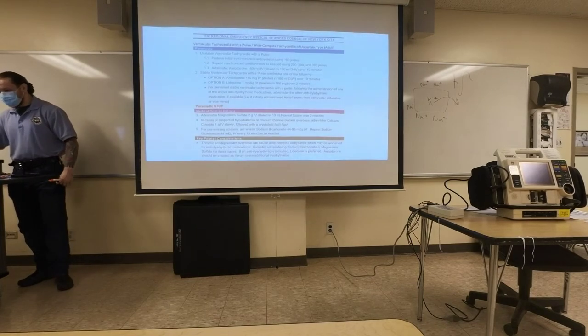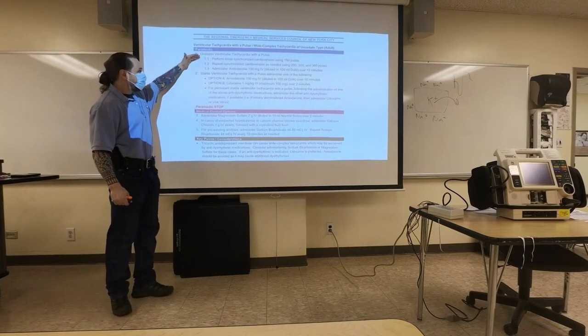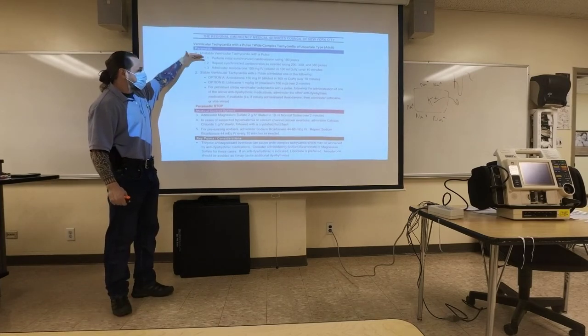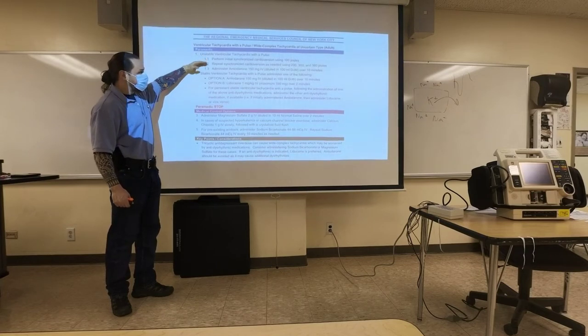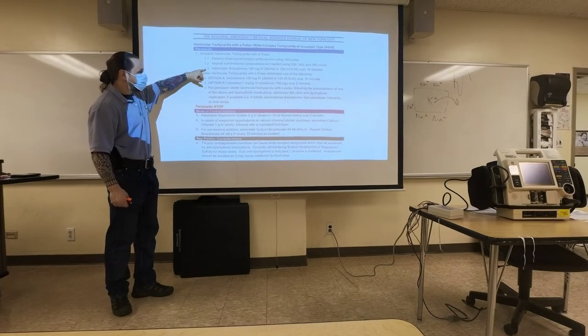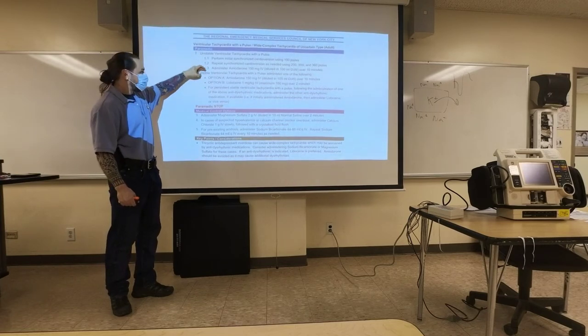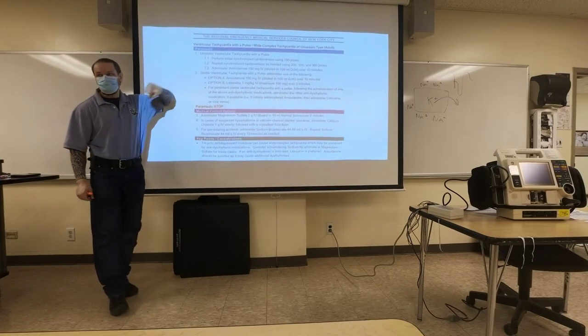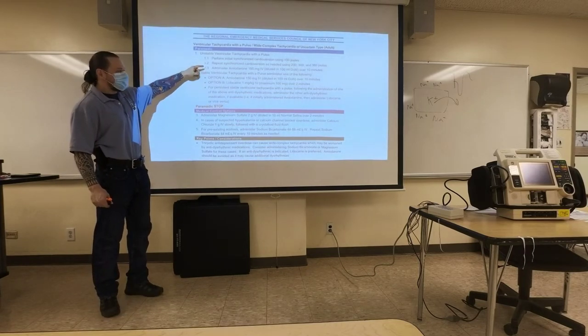Right. So this is the whole sequence, right? Unstable, right? You notice how there's three things. It says perform initial synchronized cardioversion, right? Then you repeat synchronized cardioversion, and then you have administration of the antiarrhythmic on the other. Do we do all of this? No. If the synchronized cardioversion works, then no. If it doesn't, then... So let me give you a case.